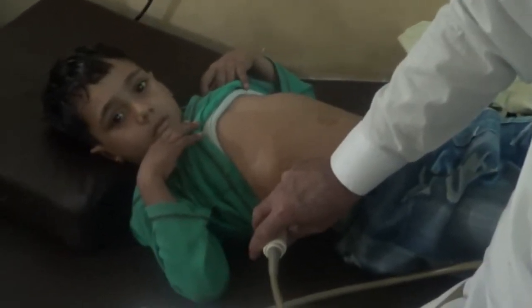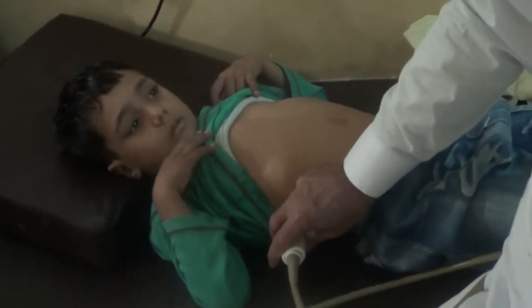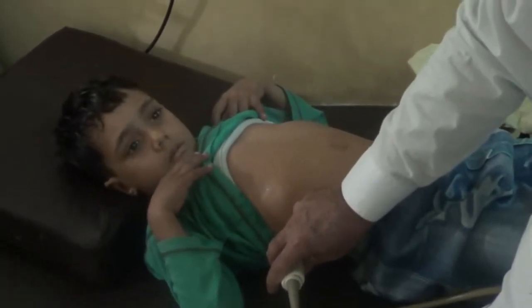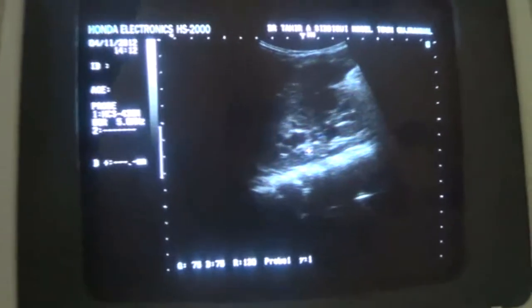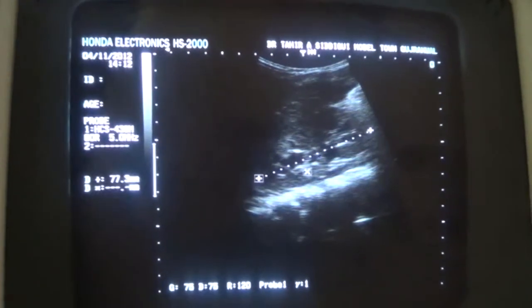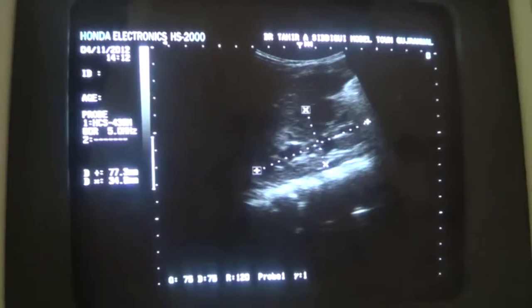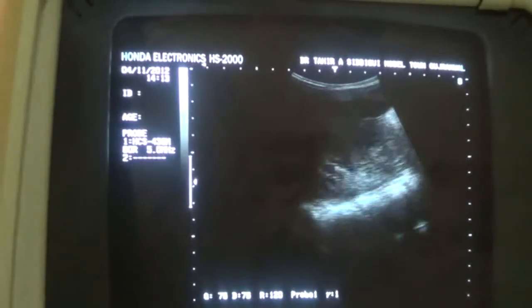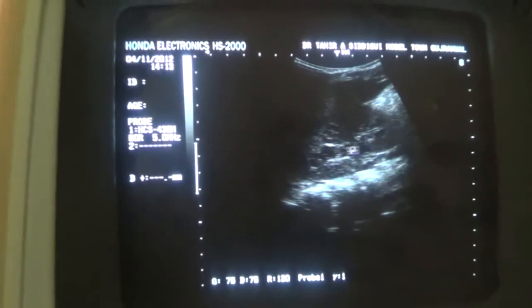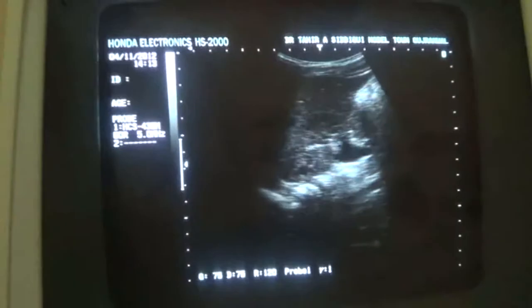This is a six-year-old boy presenting with the history of right ureteric colic. Here we see the right kidney, normal in size, with no stone, and minimally dilated calyces. These are the minimally dilated calyces, and this is the proximal ureter.